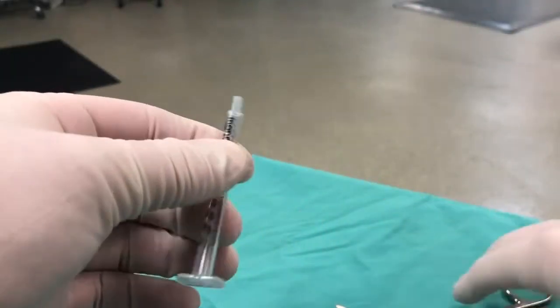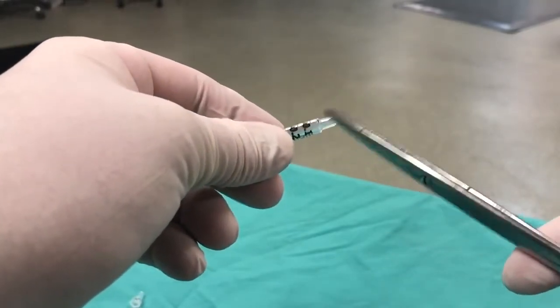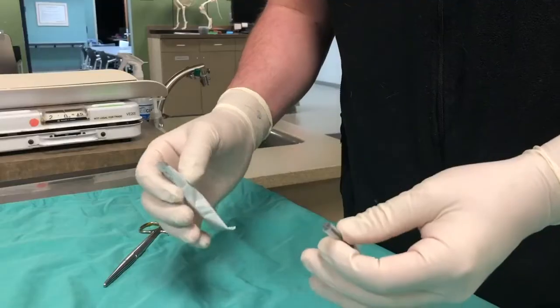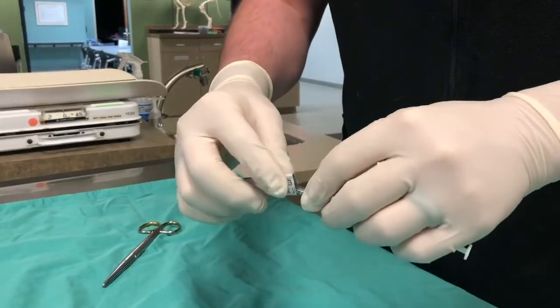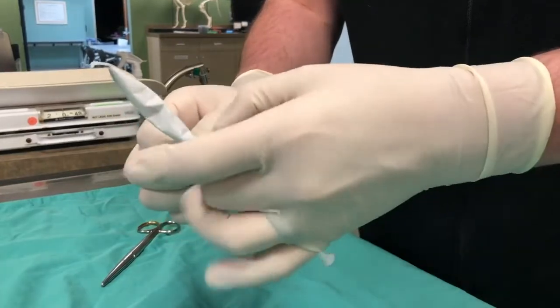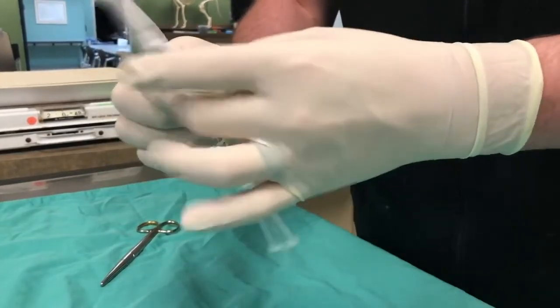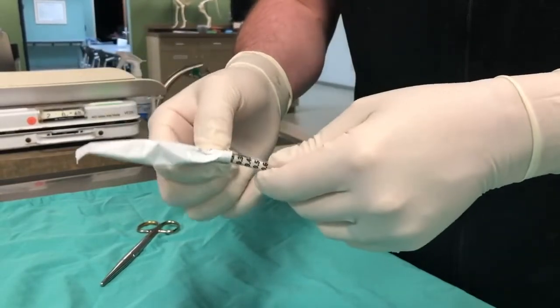Pull the plunger back to the end of the syringe to create a pathway for the hemoblock powder to flow. Place that newly cut end of the syringe into the hemoblock packet and invert that packet, pinching off the end to allow passive flow of powder into the syringe.